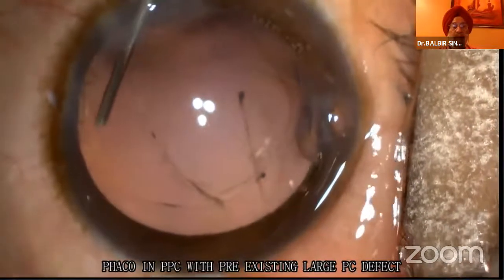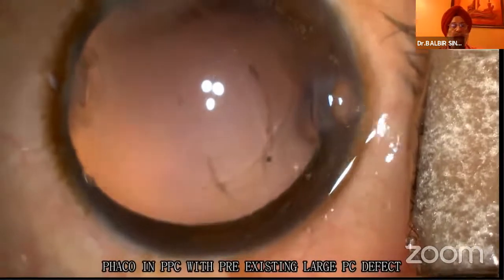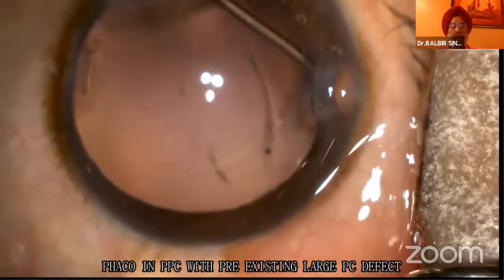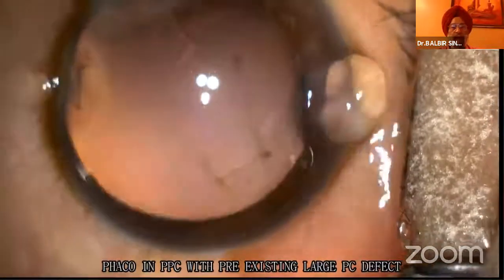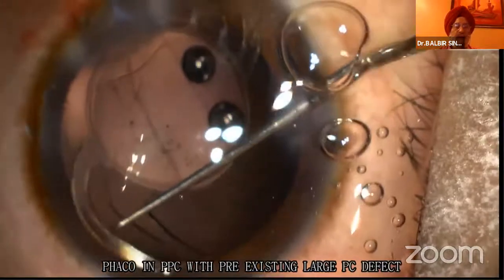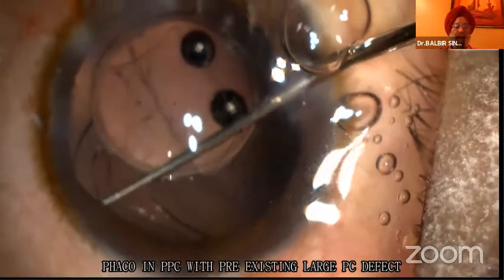I'm going to put a single piece IOL into the bag. Because of my biometry, I know I will be able to put a single piece in the bag, because the tear has thickened margins, and I don't think it will increase.